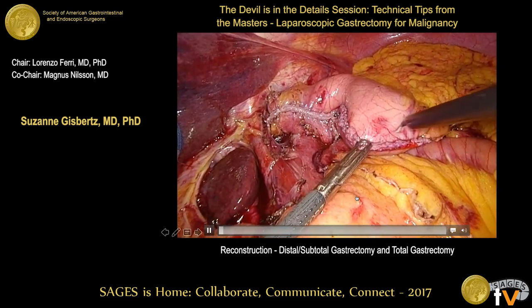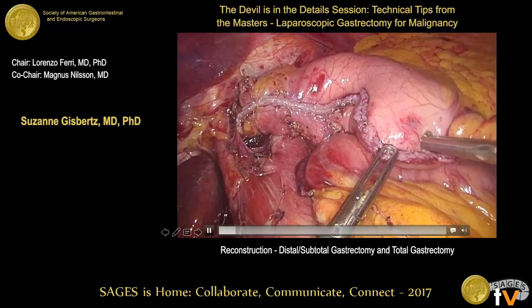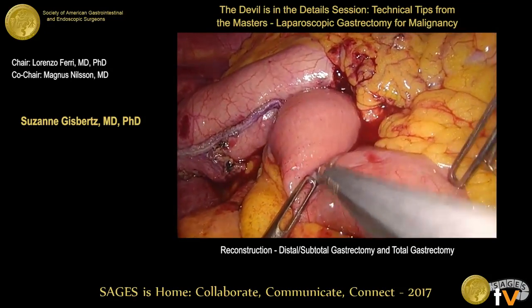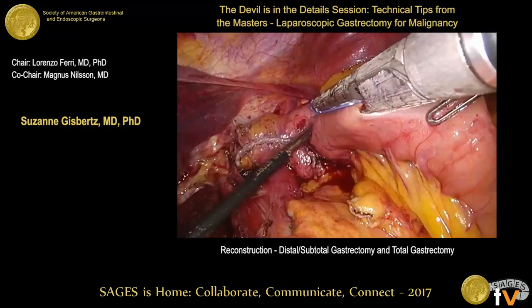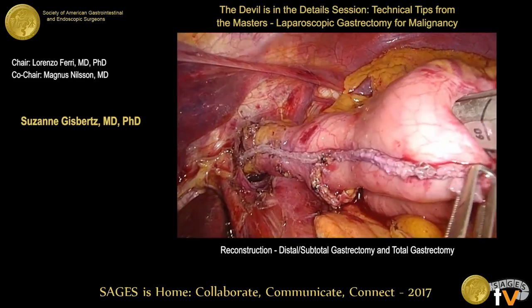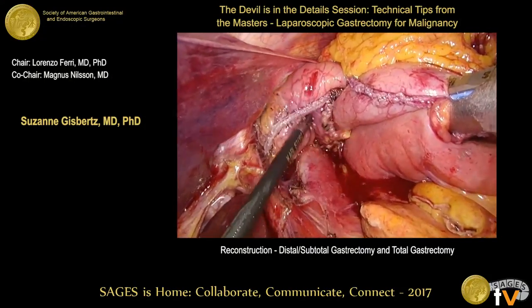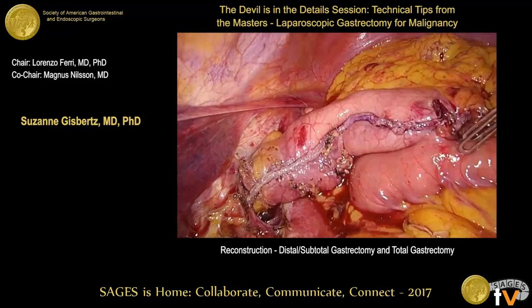A very small gastric remnant is shown — on the smaller curvature side, almost up to the esophagus. The stomach is opened at the end of the staple line, the small bowel as well, and a linear stapler is inserted. You always check that the staple is not too close to the other staple line — the bridge between the two staple lines should not be too narrow to prevent ischemia.